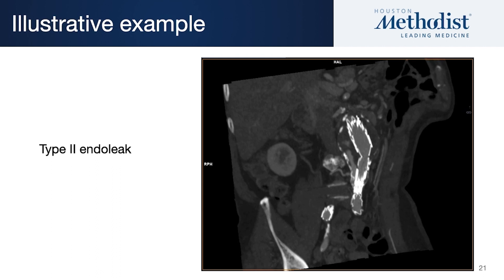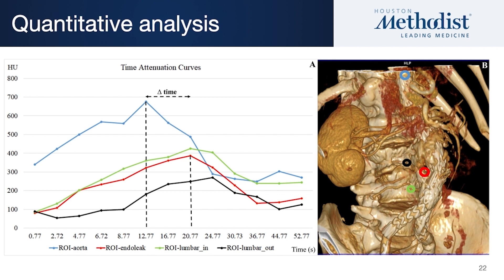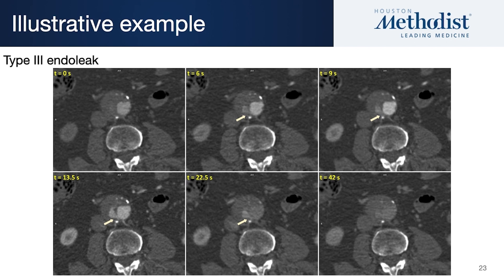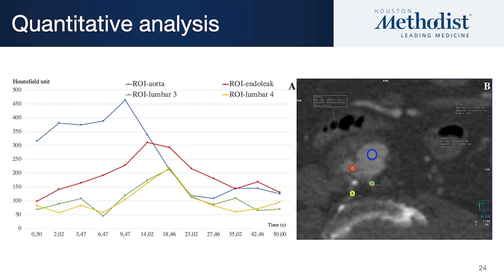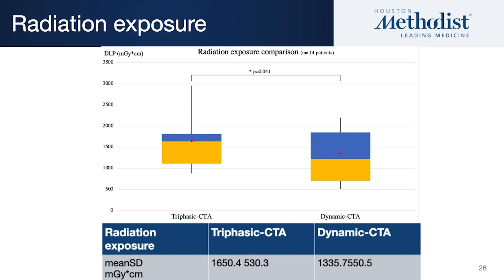Here's an example of a type 2 endoleak. You can see dye — it looks like it's refluxing from inferior, approximately. It could be a type 1b, but it's not. When you actually look at the dye arrival curves, you see that the time of dye arrival is shifted way to the patient's right. So both anatomical imaging and quantitated dye arrival times help distinguish the type. Type 3 endoleak is not very common, but they tend to be a little bit more similar to a type 1 endoleak than a type 2 endoleak, and you can actually analyze these.